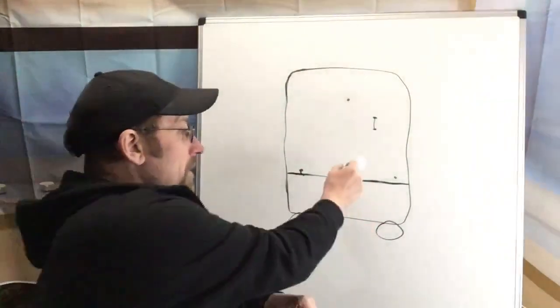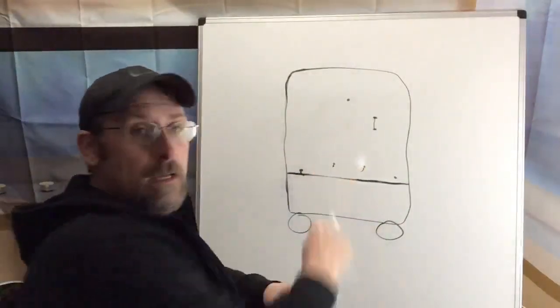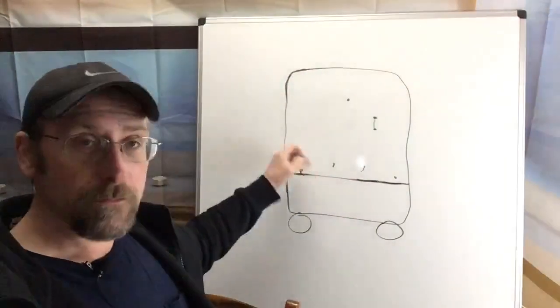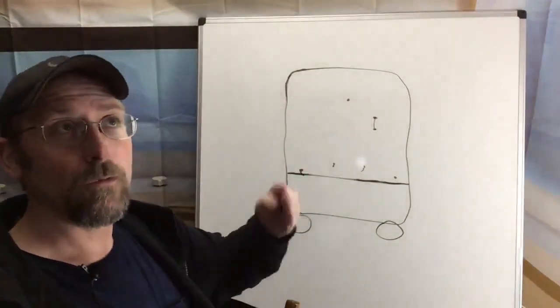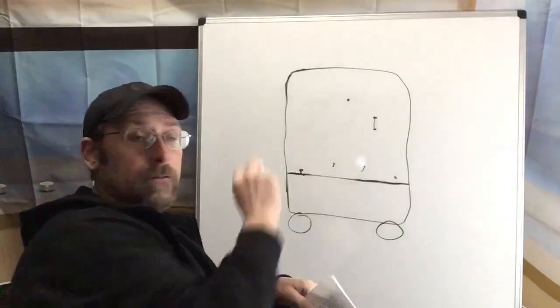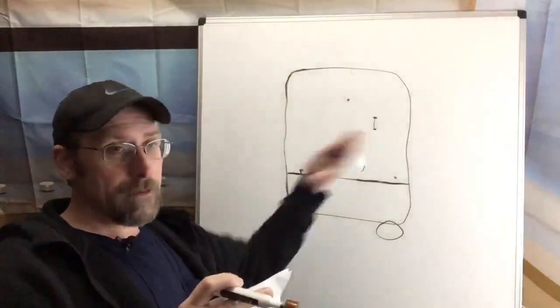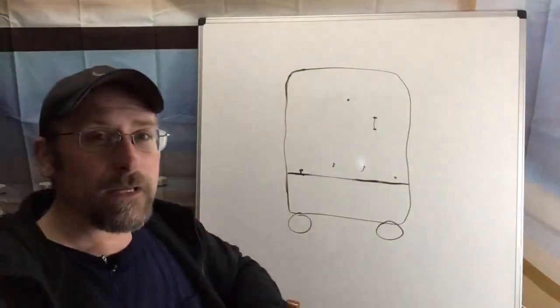And that stems from the fact that the engine inside of the machine is actually floating on springs. There's a set of springs inside, and the engine floats on it as it runs, which gives all that vibration, but the springs are supposed to help quiet that. But it goes into the case too, which is the foam, and the screws are supposed to keep it tight. So when any of these are out of alignment or broken, it just makes the problem worse and worse depending on how much is broken. Now the springs themselves, if one of these springs is broken, it can get as bad as, or sounds like, someone's actually shooting a gun, because the engine is banging literally against the side because it's not attached. It's attached on two or three different springs and the other one's just banging back and forth. With that being the case, that's your worst case scenario.